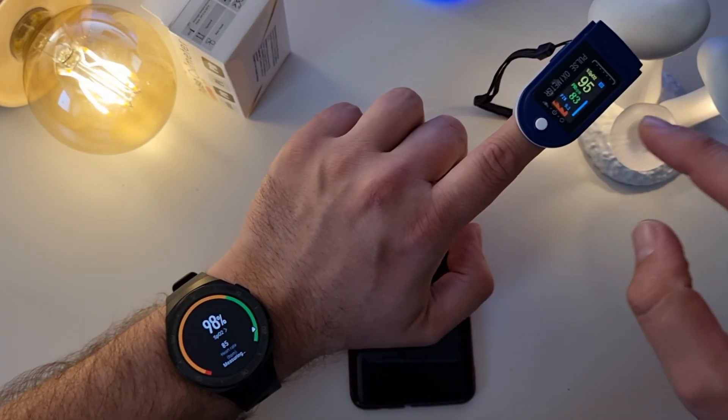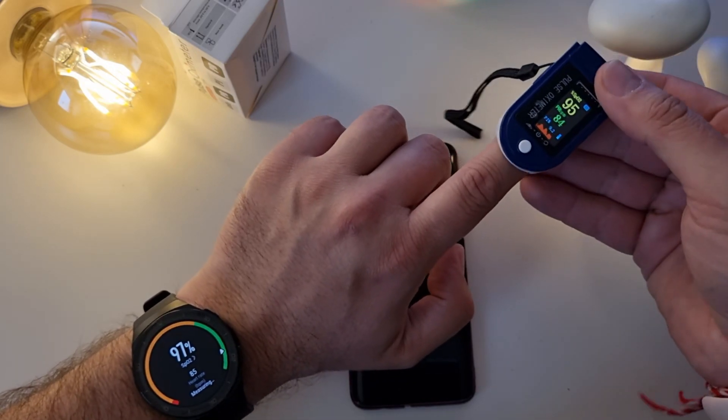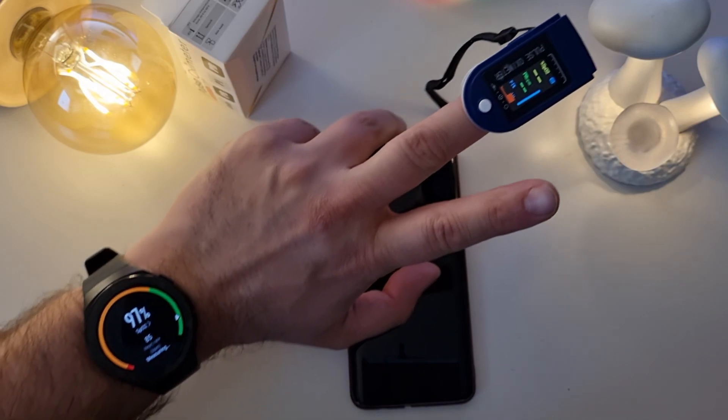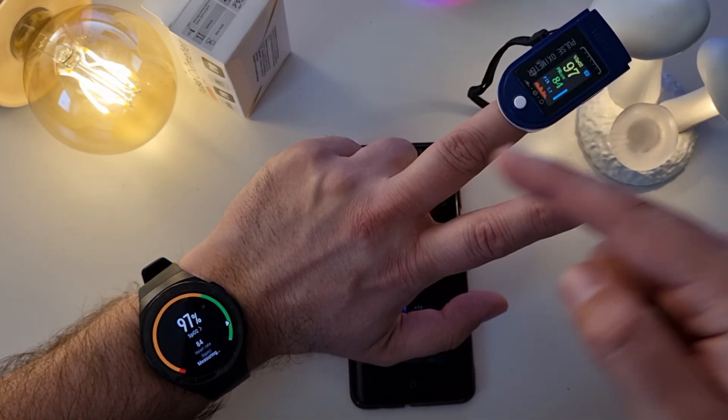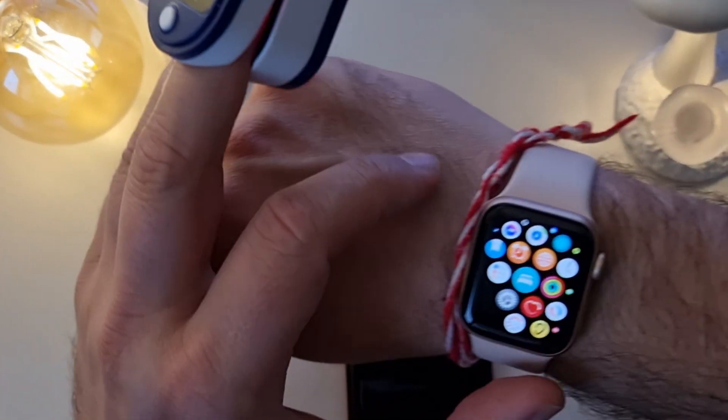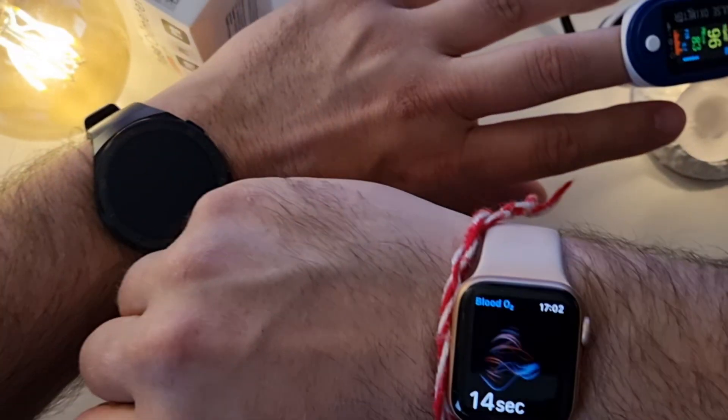The Huawei watch shows 99 percent. We can see there's a bit of a gap, so I'm going to take the pulse oximeter and put it on this finger to see if the reading is different. The watch is still measuring — 97, 97. So it's almost even.